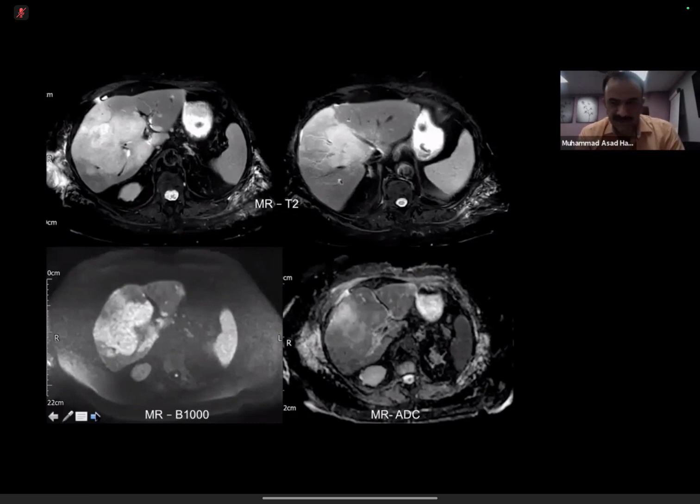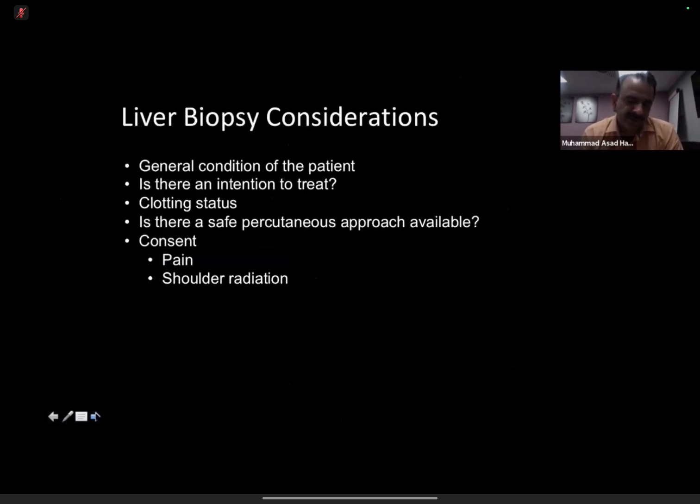Initially, you said ultrasound guidance. We can always use ultrasound as a first choice, but we can use the CT as well to guide our needle into the appropriate area. So once the examiner asks, you can describe the technique. Also, the one thing which I tend to recommend is that in addition to having normal tissue, in order to perform the procedure safely, we must also try to give local anesthetic within the liver capsule, because otherwise these procedures become very painful. So we tend to infiltrate the liver capsule as well.